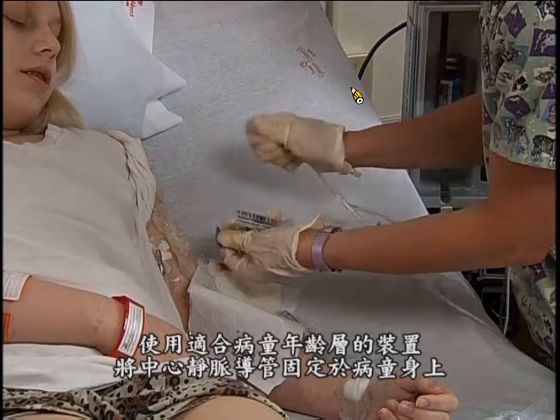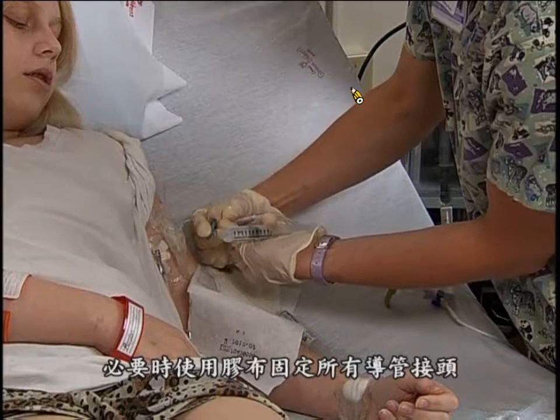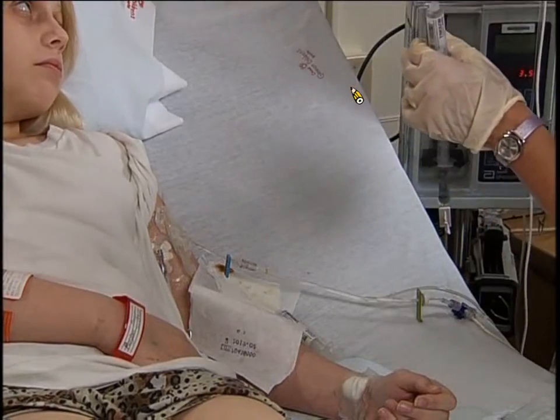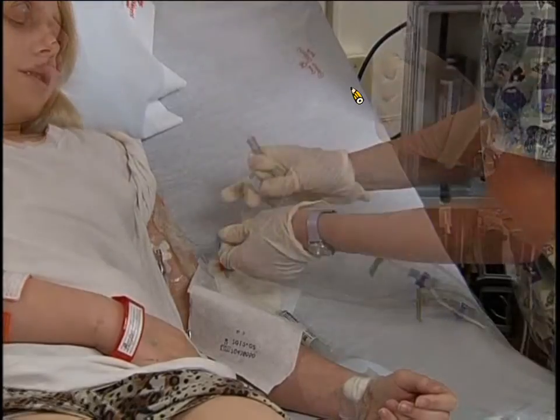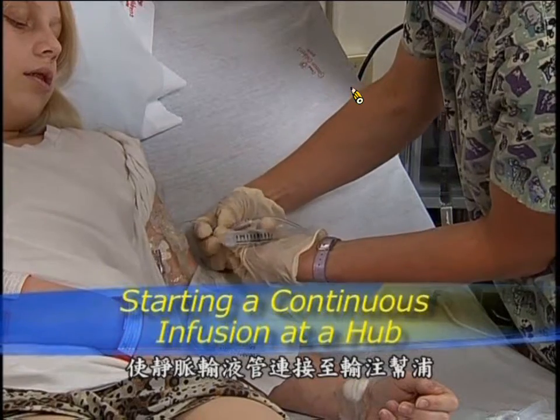Secure the central venous catheter to the child using an age-appropriate device. And tape all non-Luer catheter junctions as needed. If you need to start a continuous infusion at a hub, set up the IV tubing for an infusion pump and prime the line.